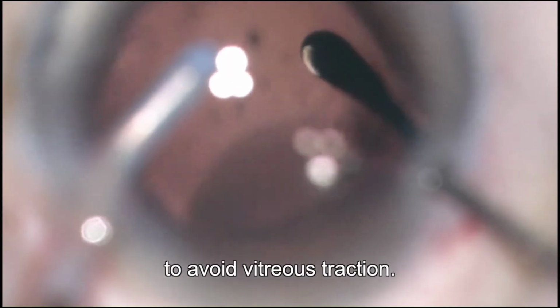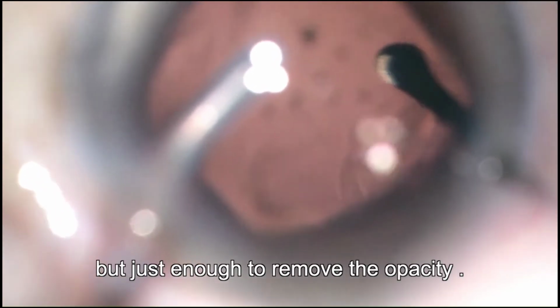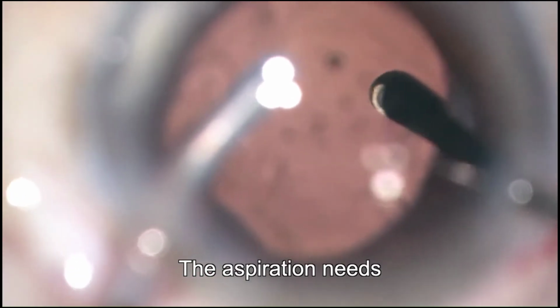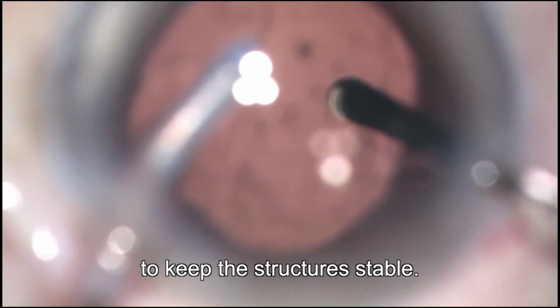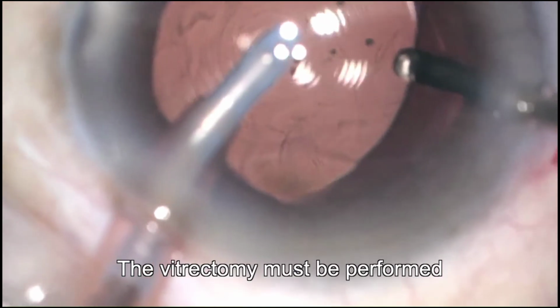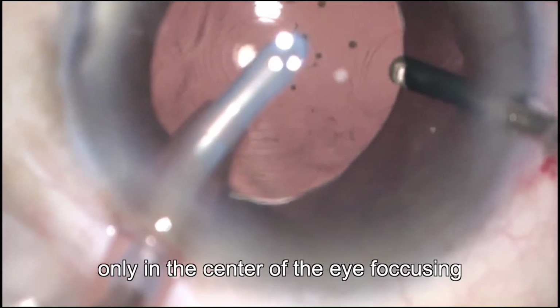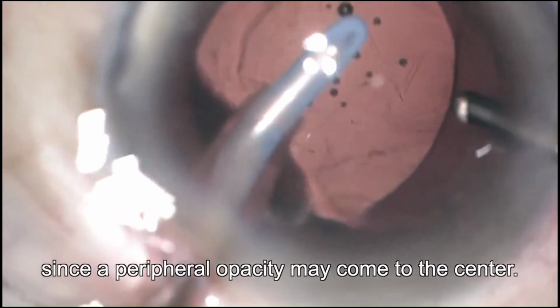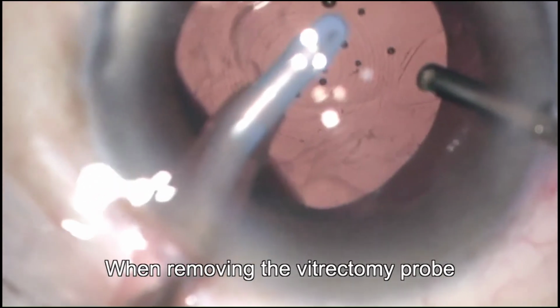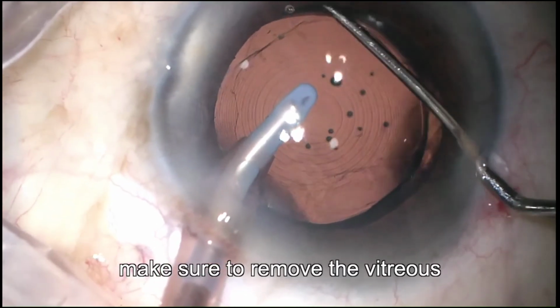In doing so, the velocity of the vitrectomy must be high to avoid vitreous traction. The aspiration should not be too high, but just enough to remove the opacity. The aspiration needs to be proportional to irrigation to keep the structures stable. The vitrectomy must be performed only in the center of the eye, focusing only on the opacity that disrupts the visual axis, since a peripheral opacity may come to the center.